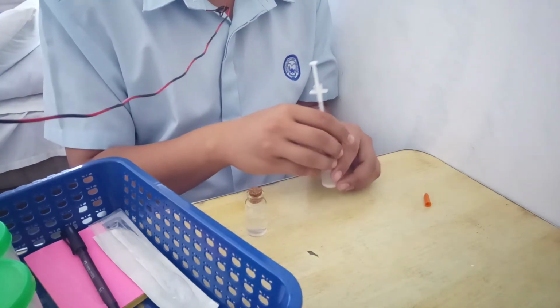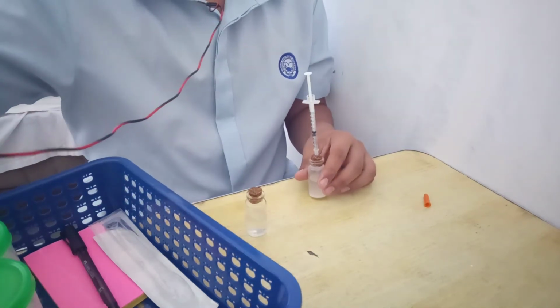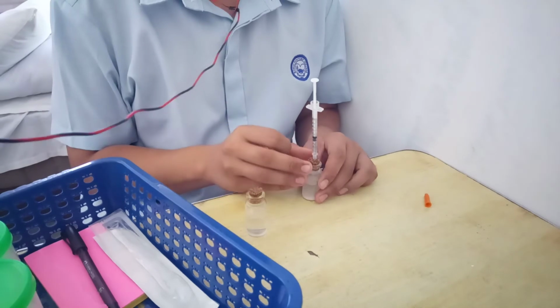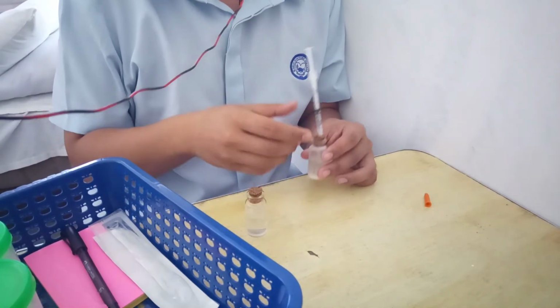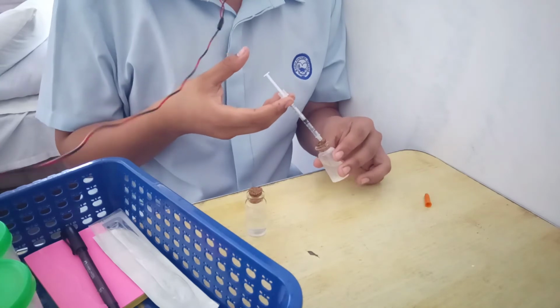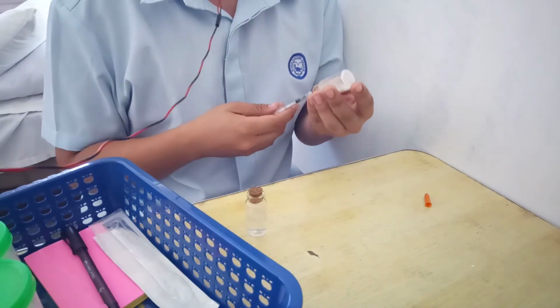Since we inserted 10 units of air before, it is also equal to the insulin that we must withdraw from the vial, which is also 10 units.